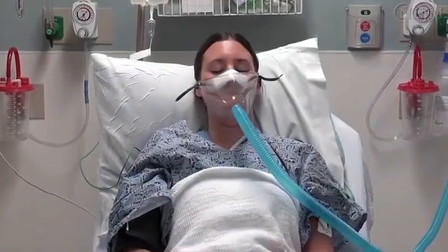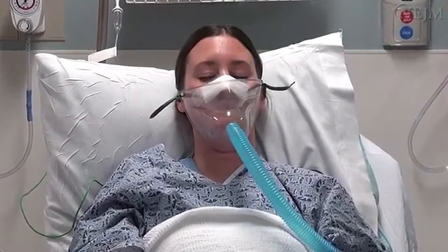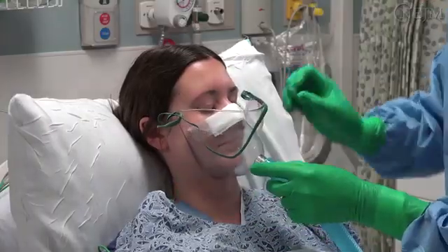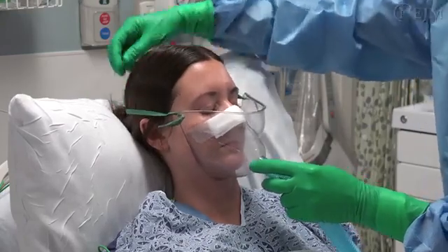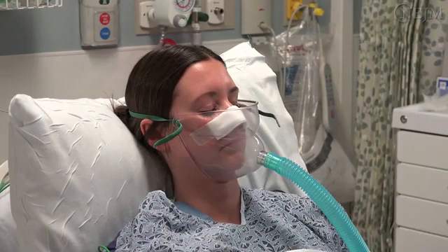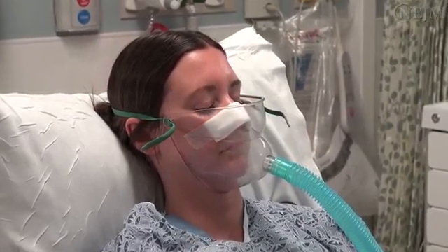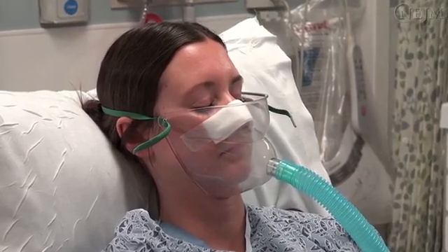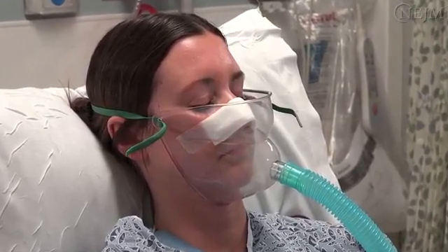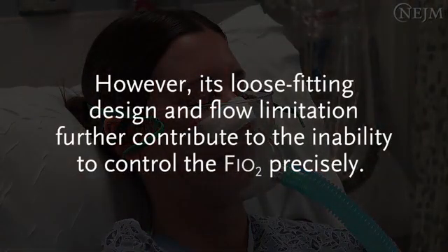Some patients may find that the face mask feels confining. A face tent provides a controlled concentration of humidified oxygen through an open mask that fits under the patient's chin, covering the nose and mouth without creating a seal around the nose. With a flow rate of 5 to 15 liters per minute, it can provide an inspired oxygen concentration of up to 50%. Placement of a face tent is ideal for patients who cannot wear a tight-fitting mask. However, its loose-fitting design and flow limitation further contribute to the inability to control the FiO2 precisely.